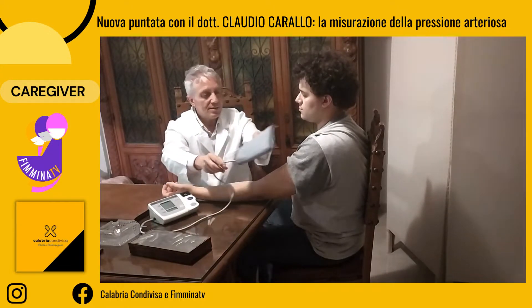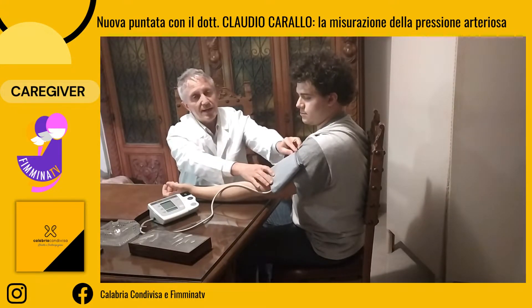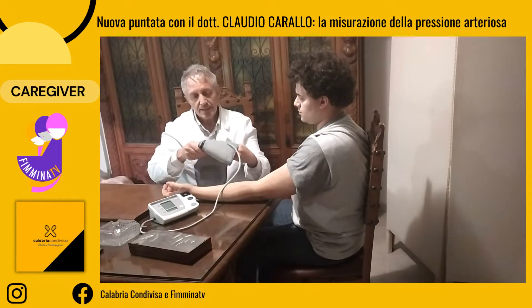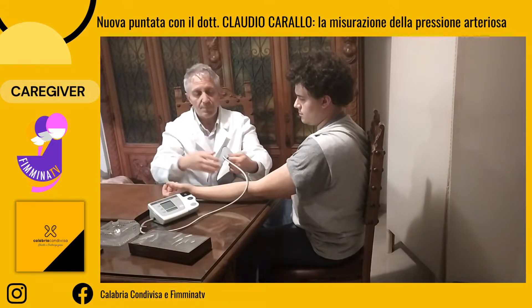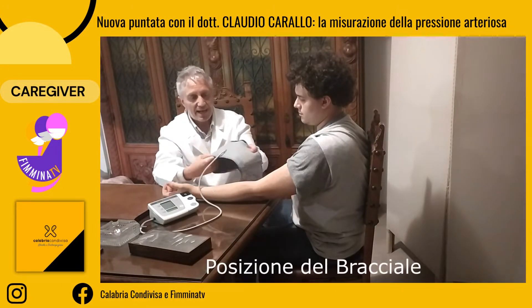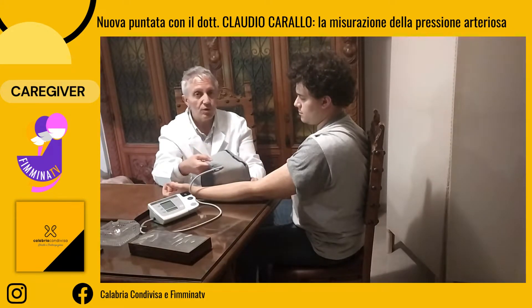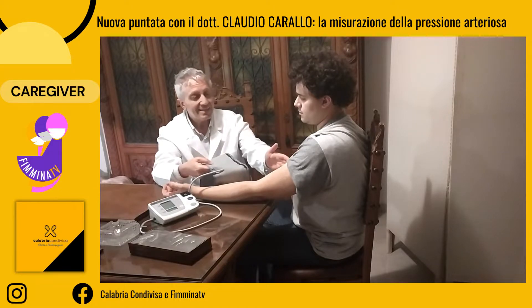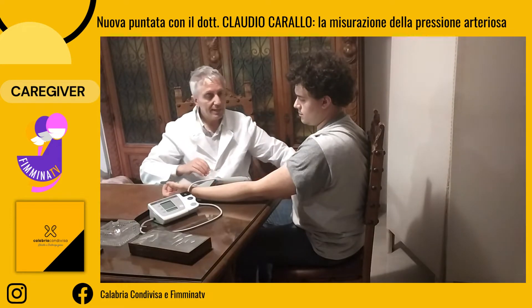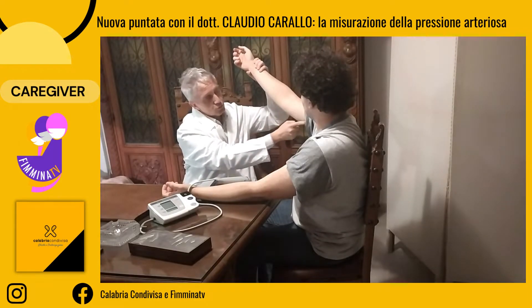Scegliamo un bracciale che abbia una dimensione appropriata per il braccio cui dobbiamo fare la misurazione. Il bracciale si compone di un manicotto gonfiabile, che è quello a cui è collegato il tubo collegato al manometro. È questa parte del bracciale che deve essere messa a contatto con l'arteria del paziente. L'arteria non decorre al centro del braccio in questo punto, ma decorre nella parte interna del braccio, sotto il muscolo.